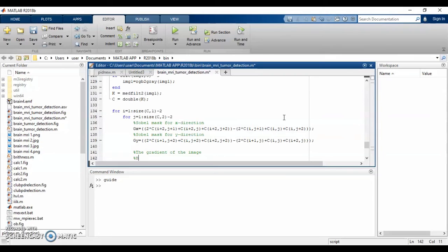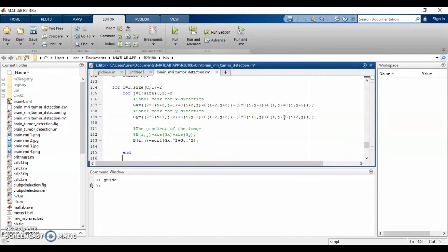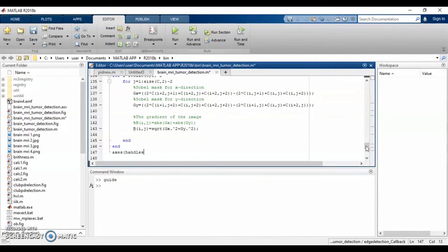So next, we will find out the gradient of the image using the formula as shown. And then we will show the image in the third axis. So we will label the image as edge detection.